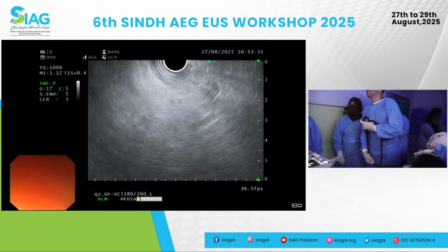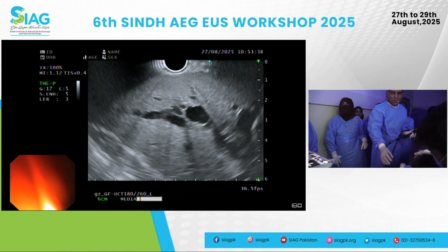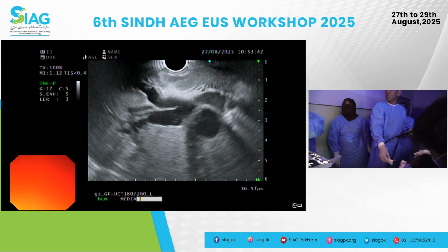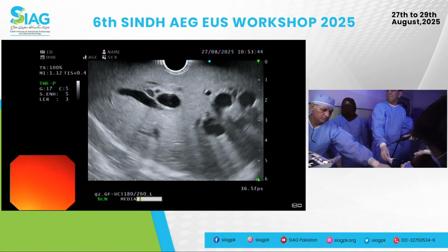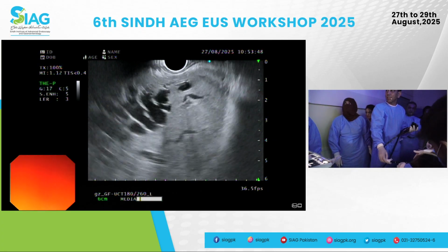But now you are in the stomach. I'm falling back, yes. But in the interest of time, we'll go to the mediastinum. Gauze piece please. So all I'm going to do is come back. We've seen this before. Come to the IVC.